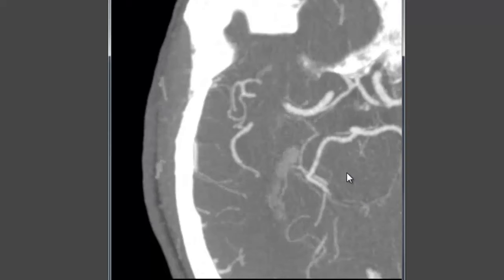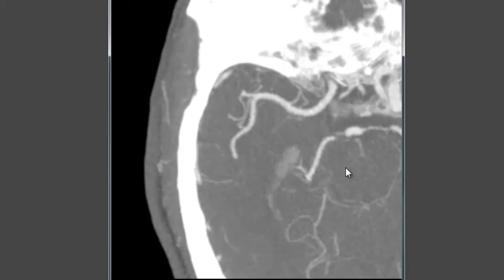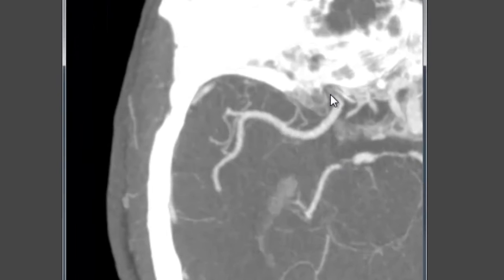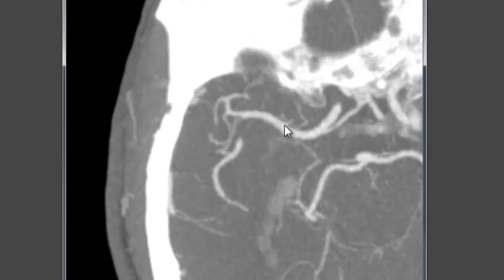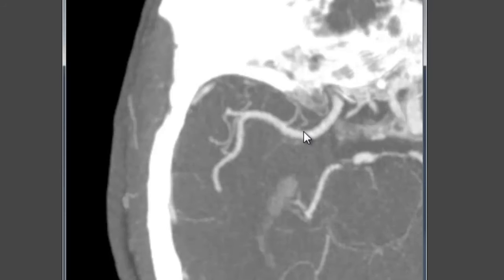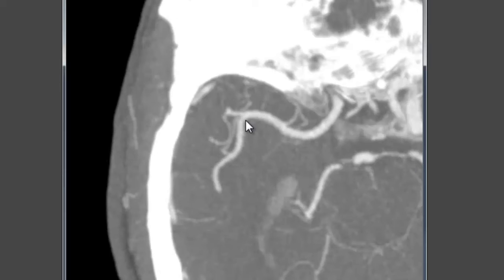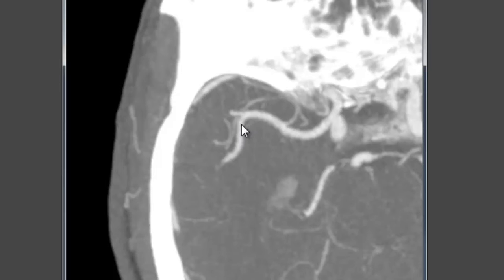In this example, we have an axial thick MIP reconstruction of a CT angiogram. We're looking at the patient's right anterior circulation. The internal carotid artery comes up to the terminus, where we find the takeoff of the ACA A1 portion and the origin of the middle cerebral artery. There's a branch point and secondary branch points, and as shown previously, everything running relatively horizontally and moving laterally from medial to lateral — this entire segment is the M1 segment, including this straight portion.